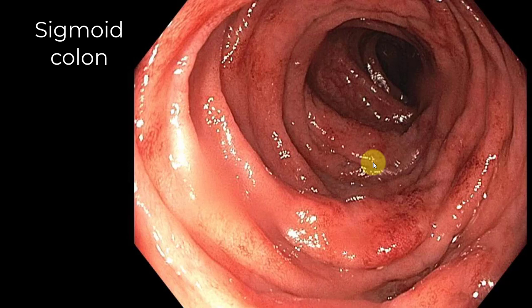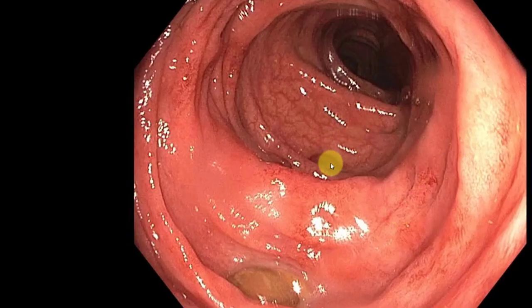The only abnormalities were seen in the sigmoid colon. So the sigmoid colon showed this congested and erythematous mucosa, and I believe there's a tick, a diverticulum, right there. But then again, take a close look at this mucosa. Here's another look at that mucosa, again that congested and erythematous appearance, and there's the diverticulum, or the orifice of the diverticulum, and perhaps there's another one there, and another one.